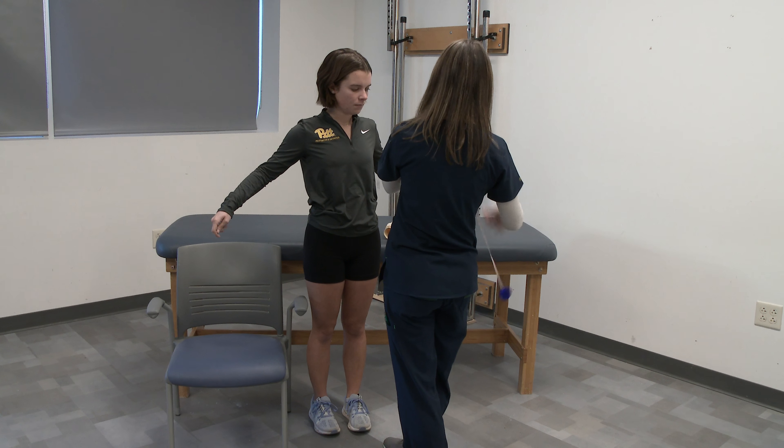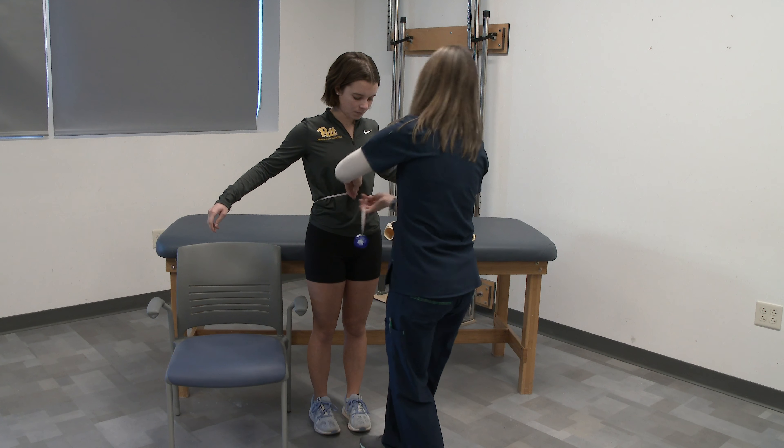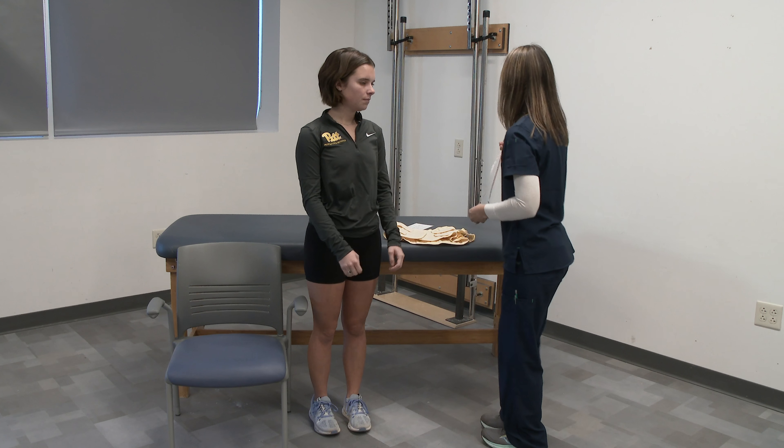Hello, today we are going to be fitting a lumbosacral corset. To measure for this, you want to measure at the patient's hips and waist circumferences.